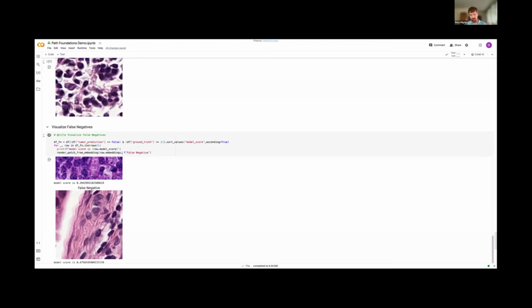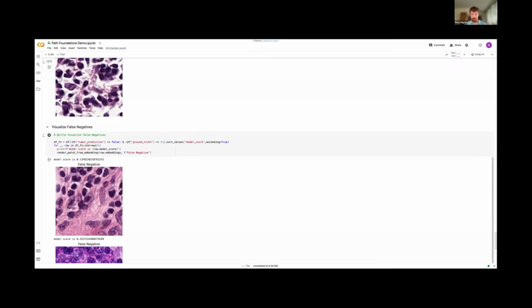So like I said, it's a very simple model because there's only 384 parameters in this model. And from there, we have a very simple equation for, once I've got an embedding, of course, I can then quickly understand, is this a high score or a low score, and then therefore is it likely to be tumor or not tumor?